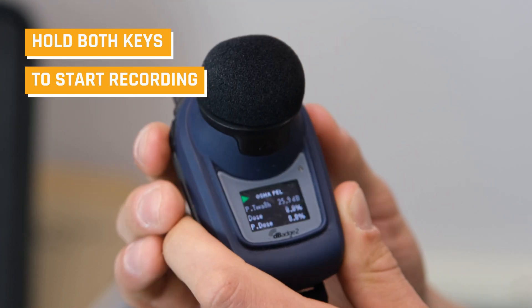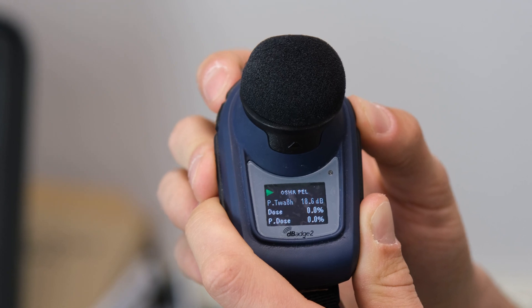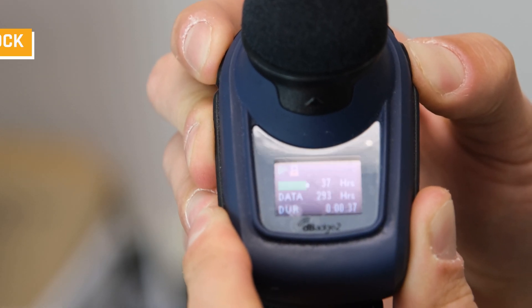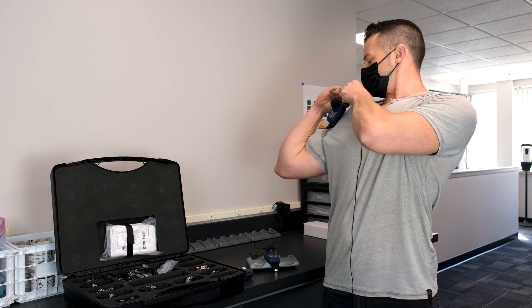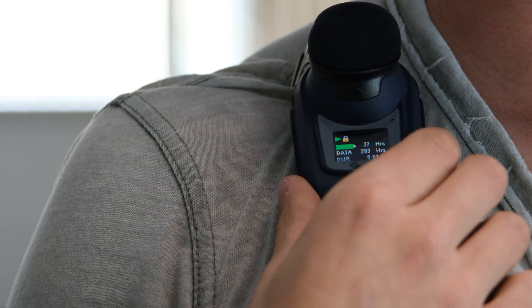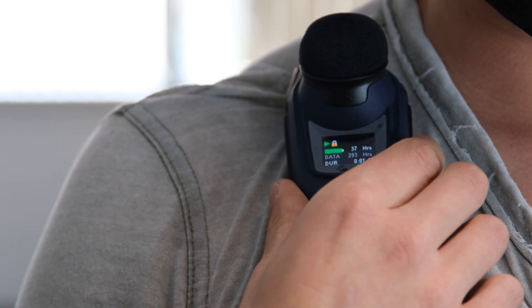We're good to place that on a worker's shoulder. A little tip: you can lock these so the worker won't bump into it or turn it off on accident. To do so, hold down the upper right key and press the left power button three times — now we have a little lock symbol and the sample is locked. Place it on the worker's shoulder near their ear, and now they're free to roam for the day and do whatever typical tasks they would do. We're looking to get that eight-hour time-weighted average — either a full work day or for a specific task.